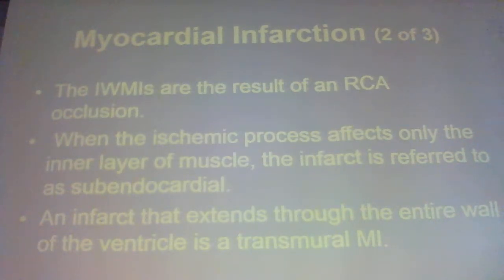So it's going to go out, but it can't go the other way. So the translation, why I'm telling you this is, pathological Q waves tell you there's a significant piece of muscle that's dead, and it's electrically silent. And what you're getting is feedback from the other side when it fires.